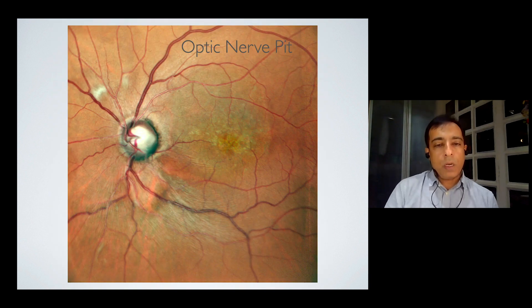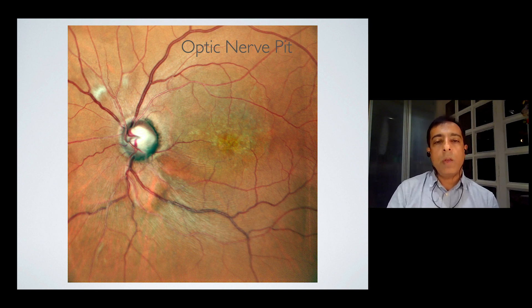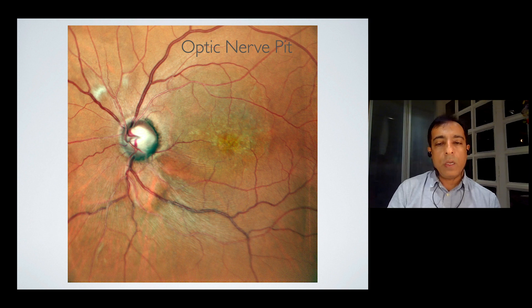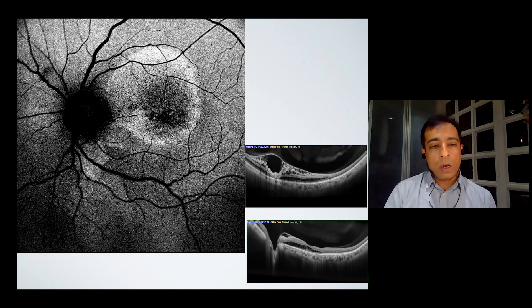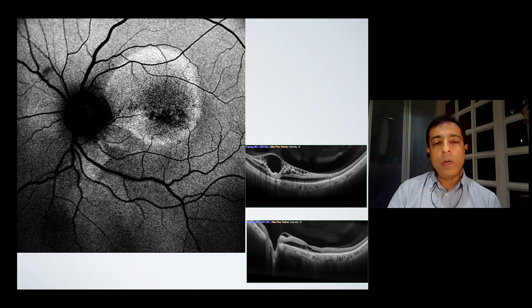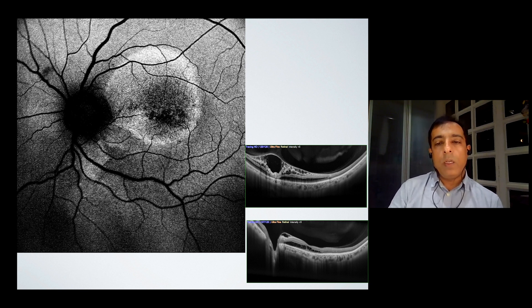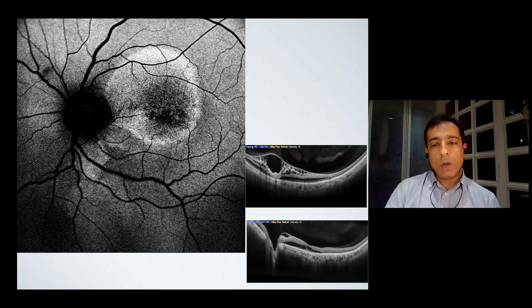This is an optic nerve pit. You see the classic hue of the detachment extending from the disc towards the macula. It is seen much better using autofluorescence — you can see the extent of the serous fluid. Also the OCT is fantastic. You get a long scan; you can take the disc along with the whole extent of the macula and see how this lesion extends from the disc towards the macular area, how the fluid collects, and where the schisis changes are. In every way, when you use multimodal imaging with these kinds of entities, it always gives you more information and a better idea of the extent of the condition.